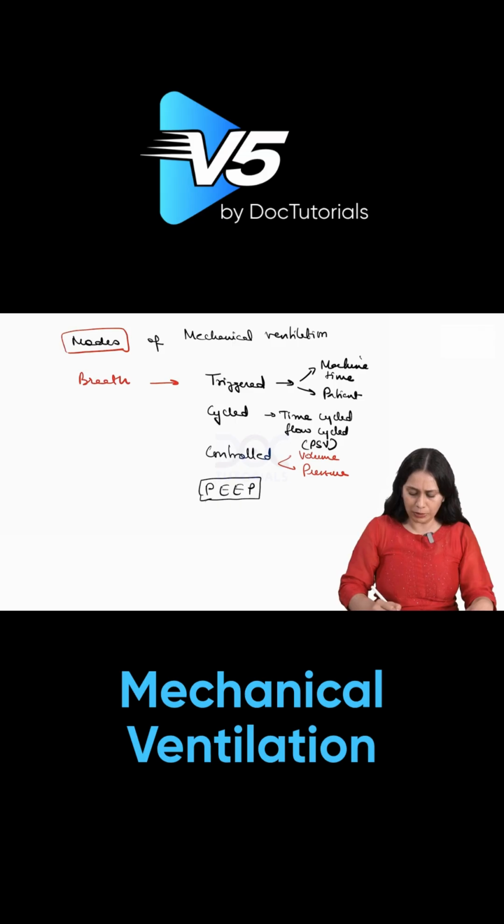So I'll talk about PEEP as well. So these are the four factors which would define a breath. So let us talk about volume control and pressure control. What do I mean by volume control and pressure control?